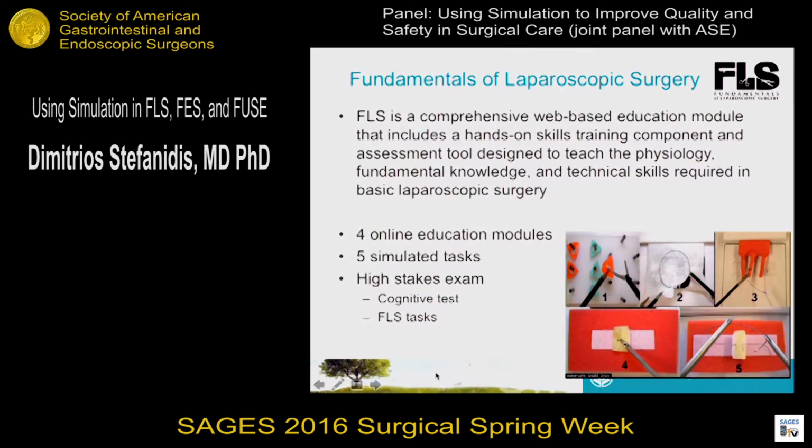There are 4 online education modules that relate to preoperative, intraoperative, and postoperative care, and 5 simulated tasks: the peg transfer, the pattern cut, the endoloop, and the 2 suturing tasks, extracorporeal and intracorporeal. There's also a high-stakes assessment that consists of a cognitive part, a multiple choice exam, as well as performance on these 5 tasks.